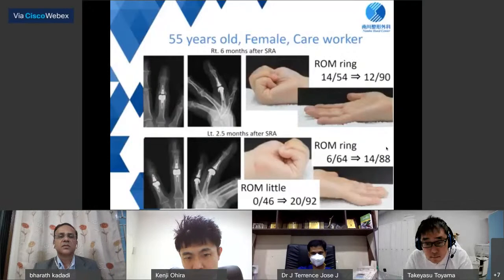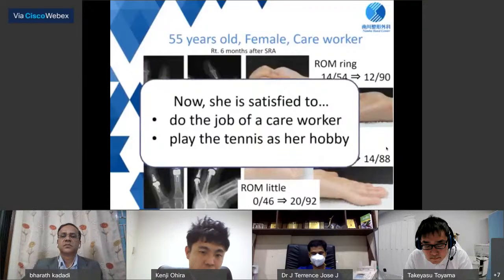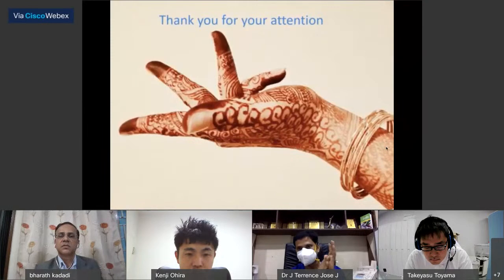She is our representative case. It's a 55 years old lady. SLFJ was inserted using a dorsal tendon splitting approach to both hands. Her ROM improved remarkably at final evaluation. Now, she is satisfied to do her job and play tennis as her hobby. Thank you for your attention.